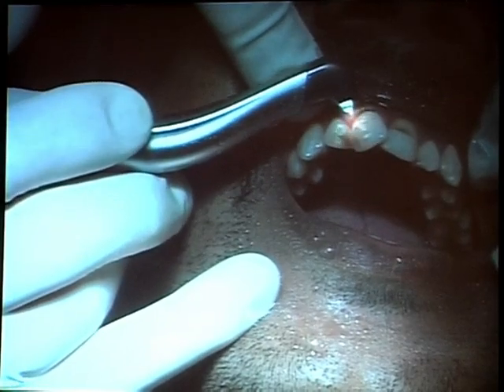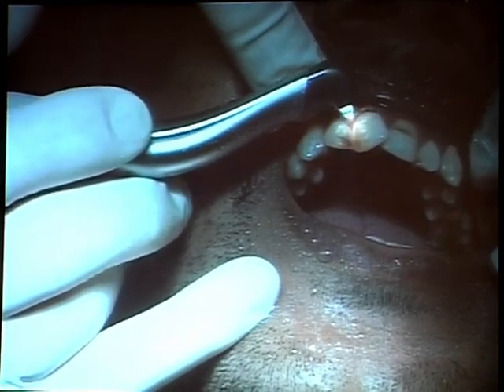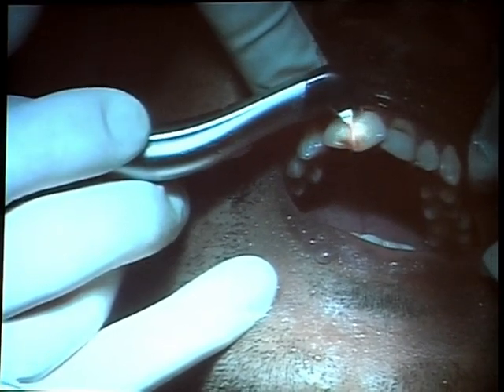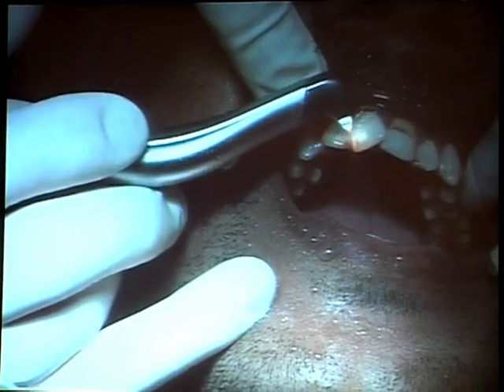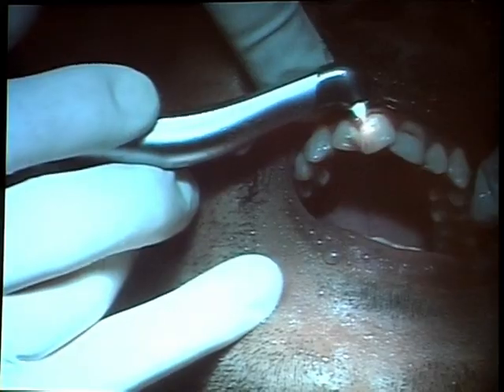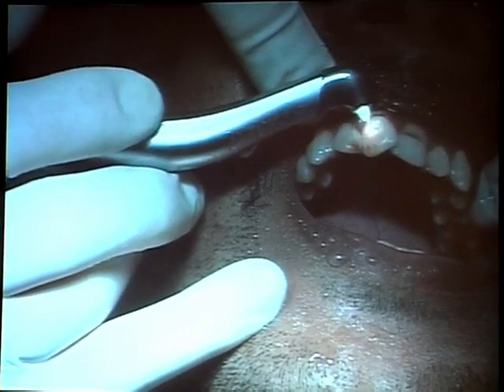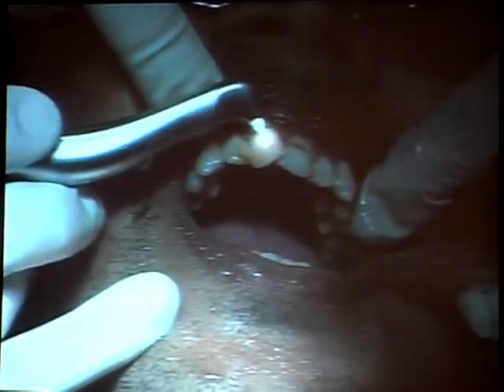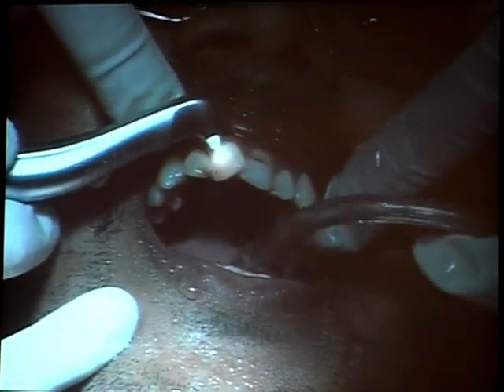And as you can see, I never use it perpendicular to the surface. The reason for that is that if you use it perpendicularly, you will get the plume going back into the handpiece and clogging the tip. So you've got to keep it at an angle.